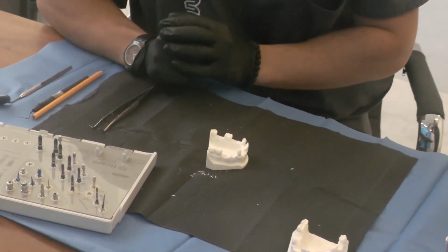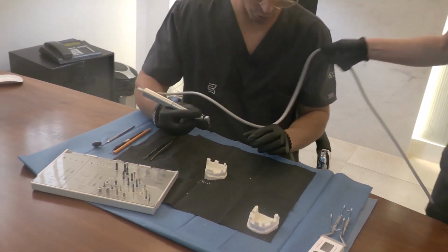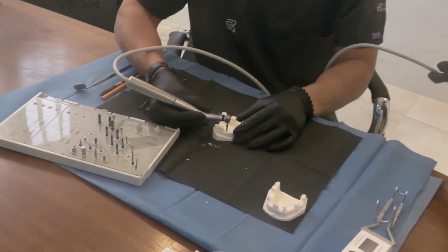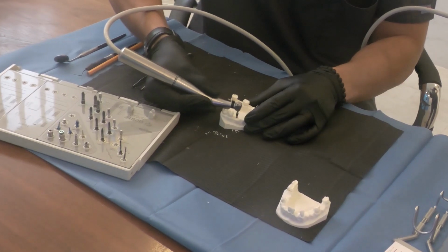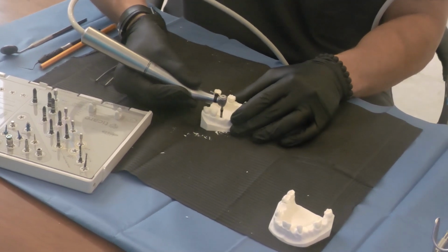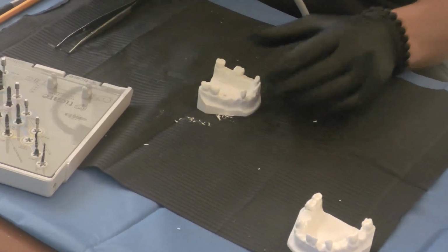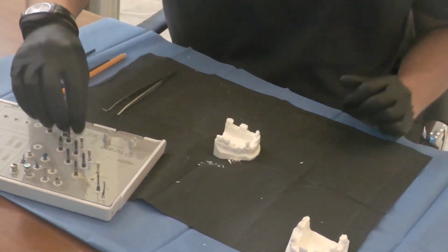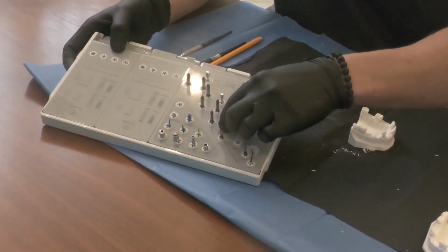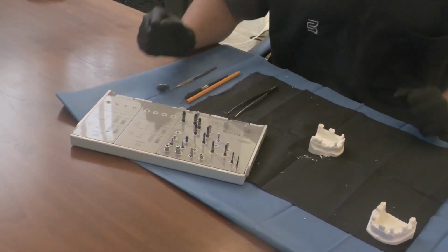My man kindly place it, and now it's time to continue the drilling again with profuse irrigation. You have to check parallelism, in and out motion, in and out motion, in and out motion, in order to minimize overheating, which can compromise the stability of the bone. Great. And now it's time to move forward because we are following the blue path. Okay, so you can see how easy the system is in order to place dental implants in a predictable manner.